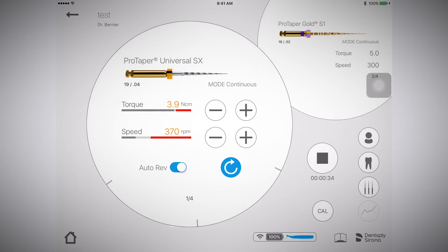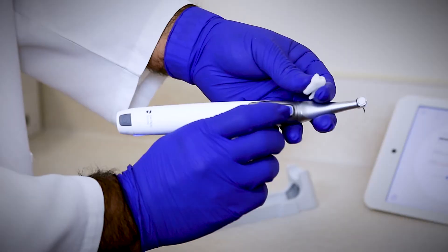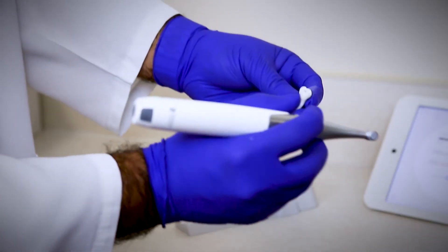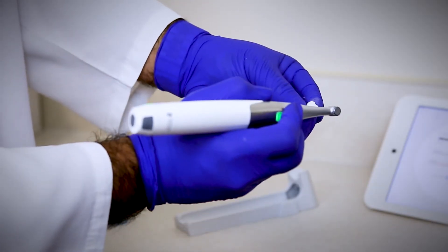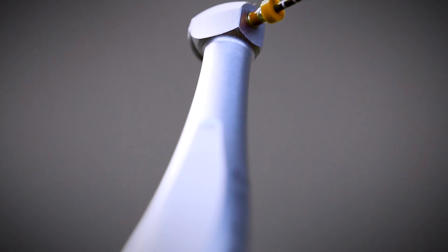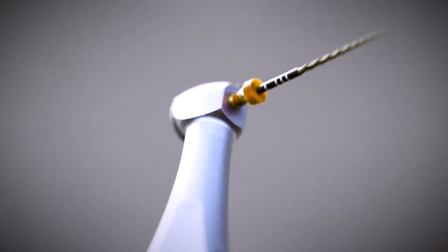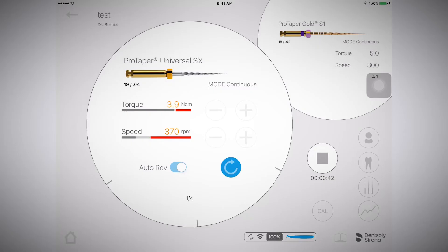To begin the procedure, press the start-stop button on the motor handpiece. You can see that this starts the rotating of the file.